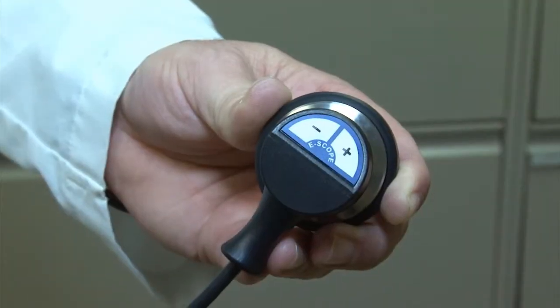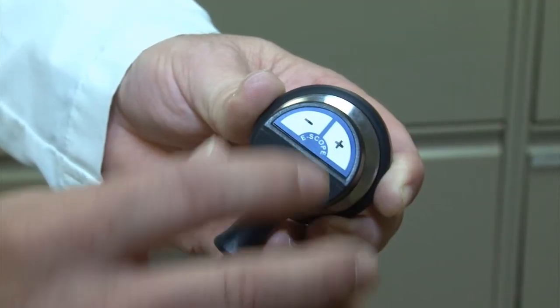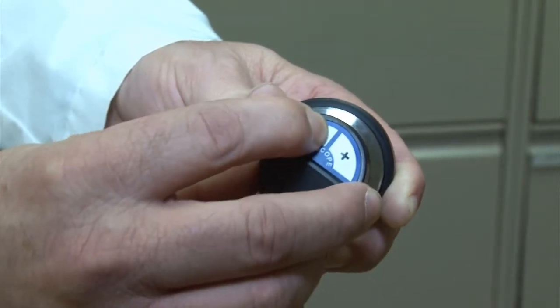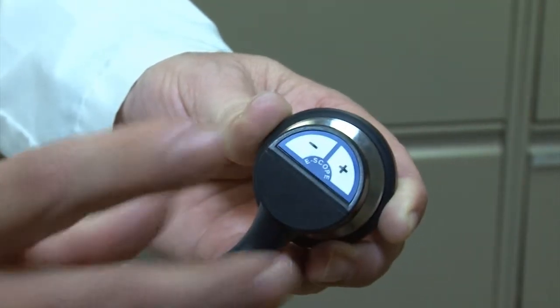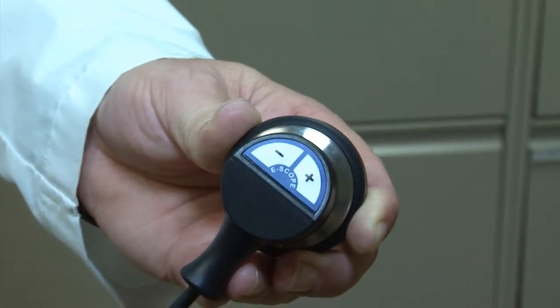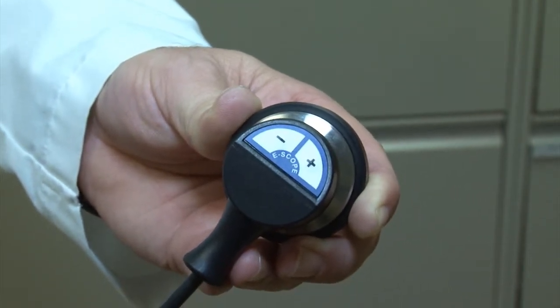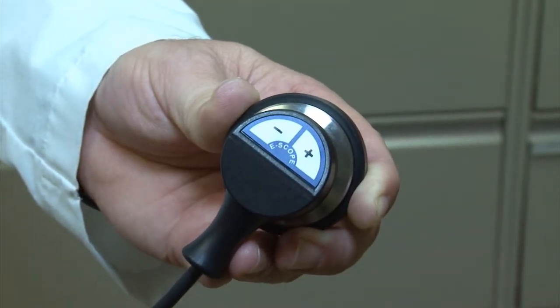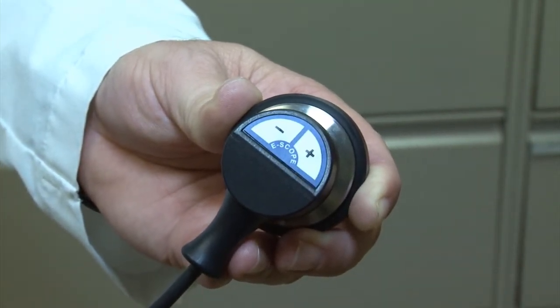Activate the SimScope by pressing any volume key located on the chest piece. A voice will alert you upon activation: System activation, verification mode.